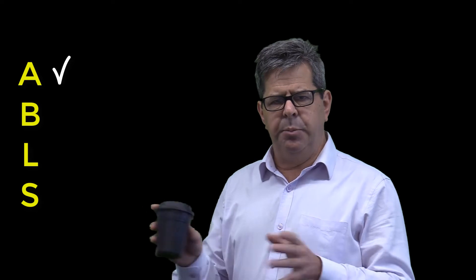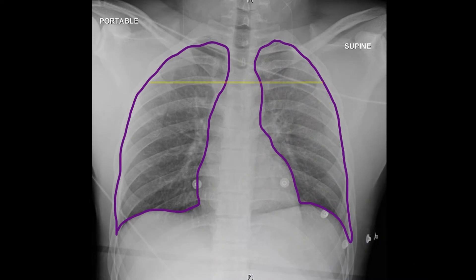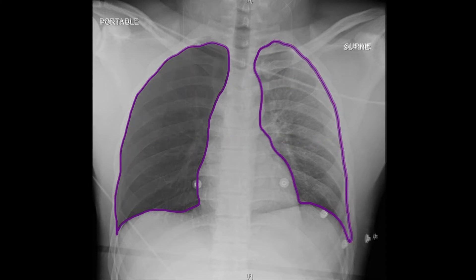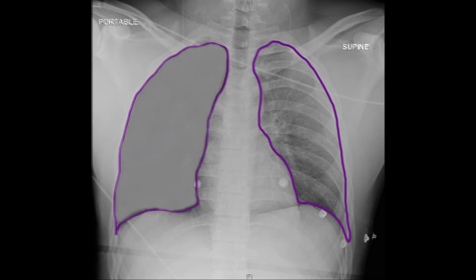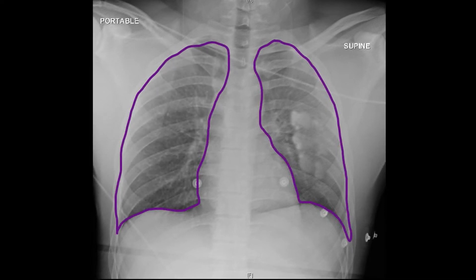That's A and B. Next is L for Lungs. Compare one side to the other — the upper, middle, and lower zones. If there's lots of black, that's going to be air, so in this context it'll be a pneumothorax. White, of course, is blood. The blood is either going to be in the pleural space as a hemothorax, or occasionally in the parenchyma as a contusion.